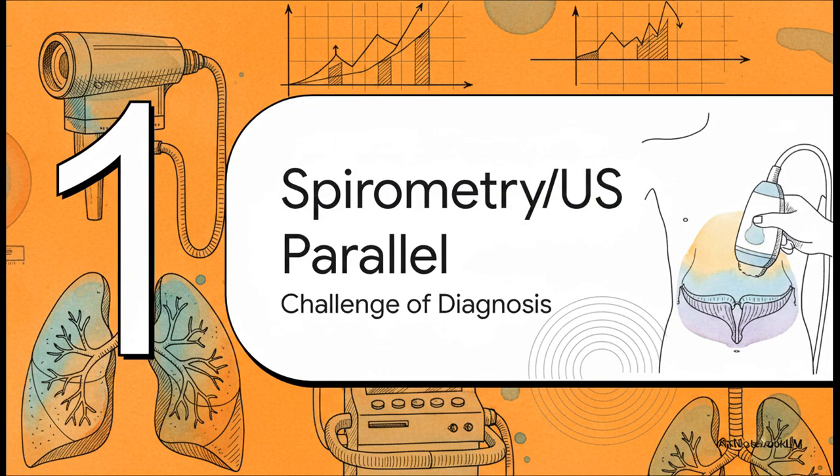We all know spirometry is our gold standard, right? It gives us these precise, hard numbers on airflow. But it takes a cooperative patient, it needs special equipment, and you can't always just whip it out at the point of care. So the authors of this study asked a really brilliant question. Could the way the diaphragm moves, something we can see with ultrasound, act as a sort of proxy?